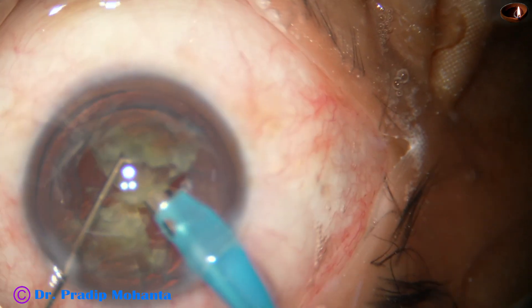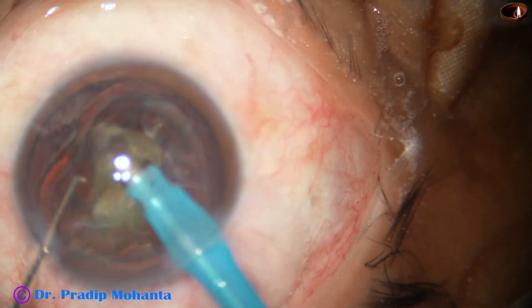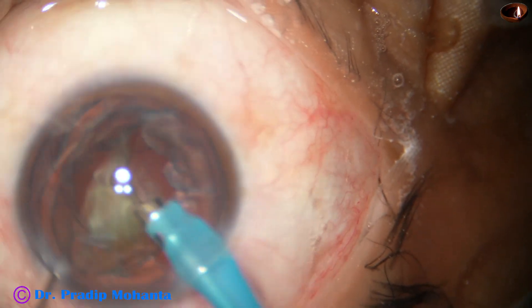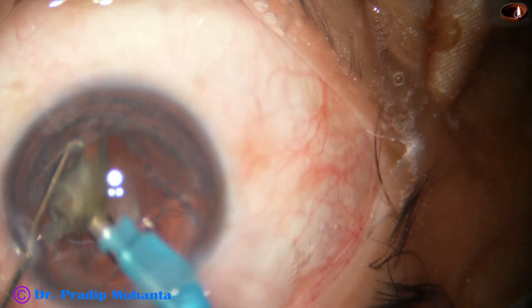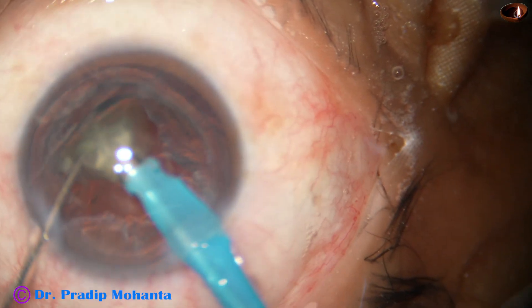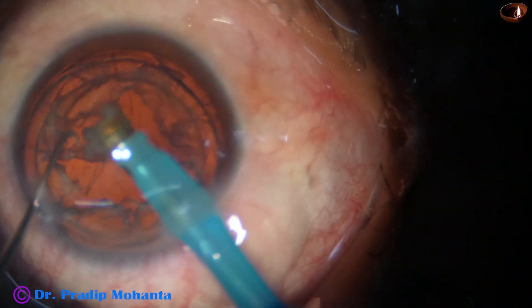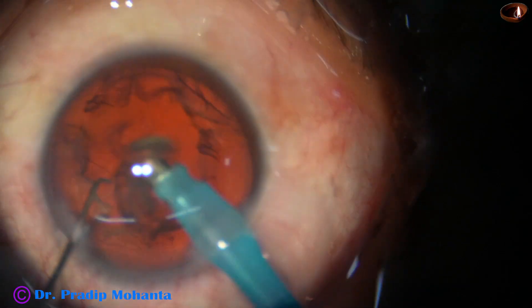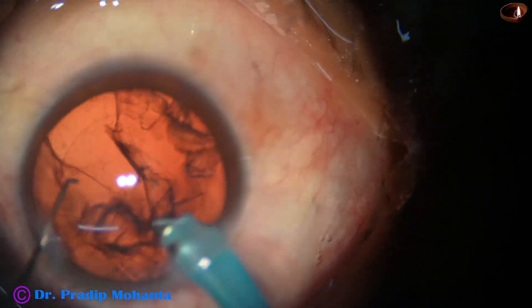USG used in this case is 75%. Flow rate is 47 ml per minute. Vacuum is 475 mmHg. Now this is the last piece. At this time I decrease the vacuum to 400 and flow rate to 40. With this setting, I remove the epinucleus and some cortex as well.